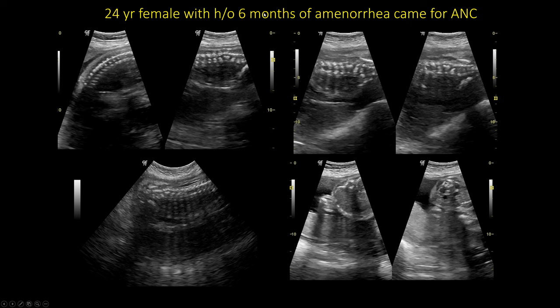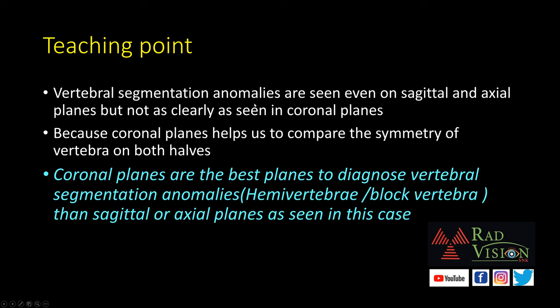Next case: 24-year-old female with 6 months of amenorrhea presenting for antenatal care. On sagittal sections of the cervical and thoracic spine, findings appear normal, but in the caudal sections at the lumbosacral junction, there is altered alignment of the posterior elements. On axial sections, the three-joint complex is disrupted. On coronal plane images, abnormal alignment of posterior elements is clearly demonstrated at the lower lumbosacral spine. This is a classical case of vertebral segmentation anomaly. The teaching point: coronal planes best diagnose vertebral segmentation anomalies such as hemivertebra or block vertebra, as they allow comparison of symmetry on both sides better than sagittal or axial planes.